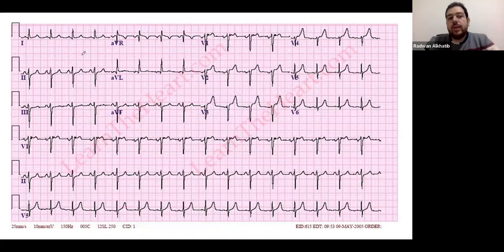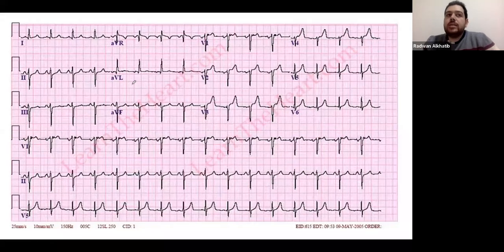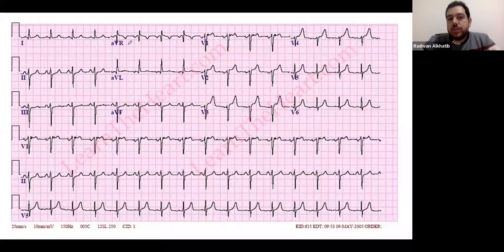The second ECG is not extreme axis deviation. For extreme axis deviation, AVR would need to be purely positive. This ECG is actually a normal left axis deviation — lead one is above, lead AVF is below, they are in opposite directions, so this is a left axis deviation.